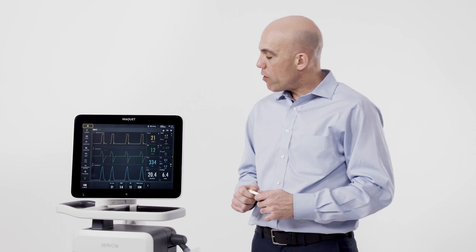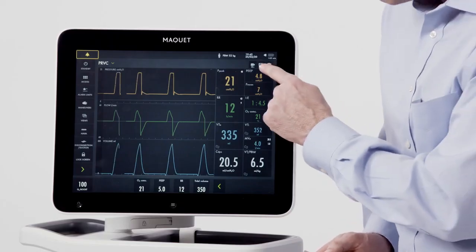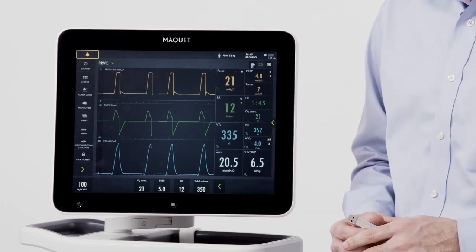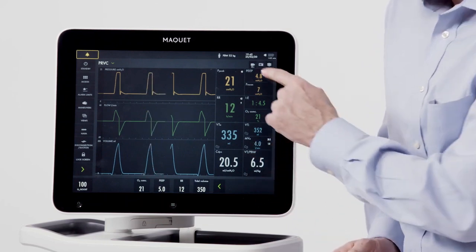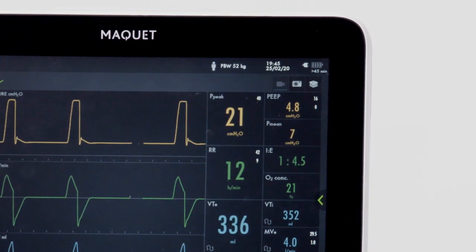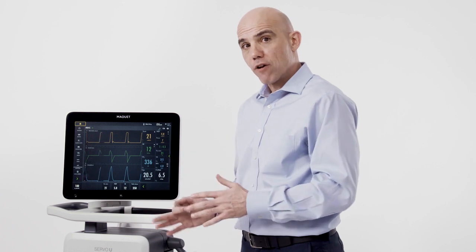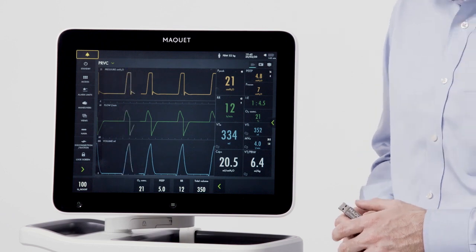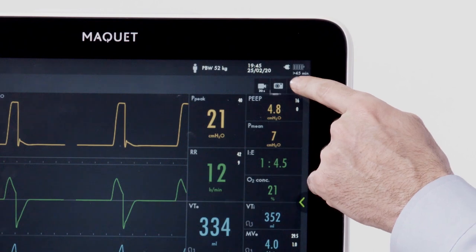Up to 40 screenshots or recordings can be saved on the ventilator, or they can be exported to a USB drive. To record a screenshot, press the camera button — when pressed, the screen is saved. To get waveform data, press the recording button — once pressed, the recording will be stored on the device. To access the media that you saved, press the media button in the upper right-hand corner of the screen.